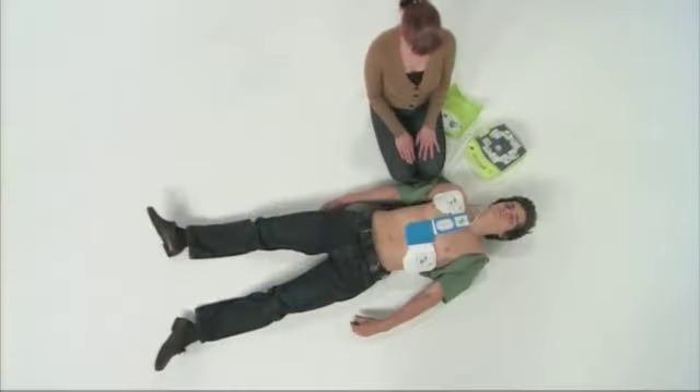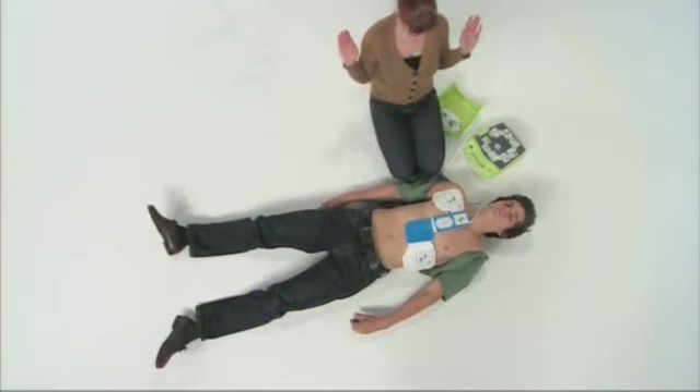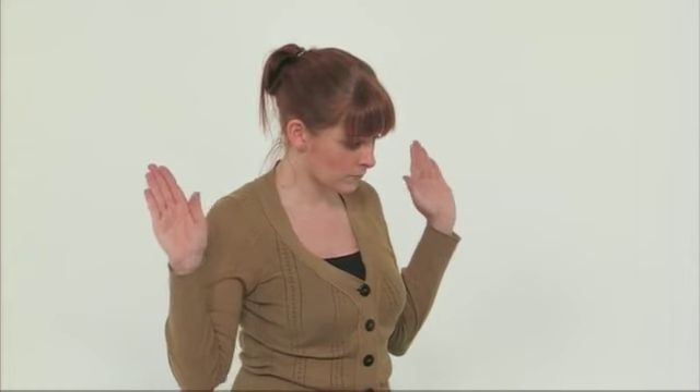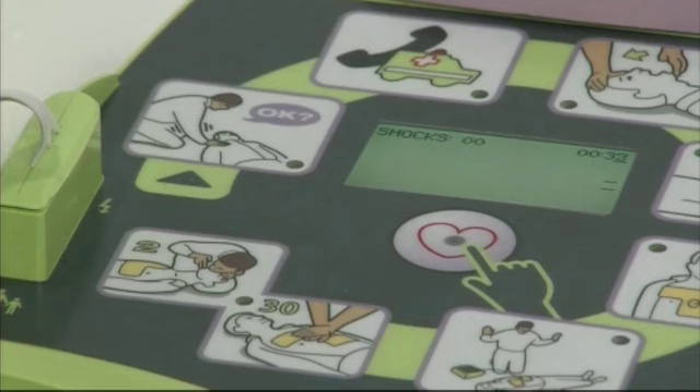Once the pads are applied, the AED Plus will automatically analyse the patient. You should not touch the patient at this point, and the AED Plus will remind you of this.